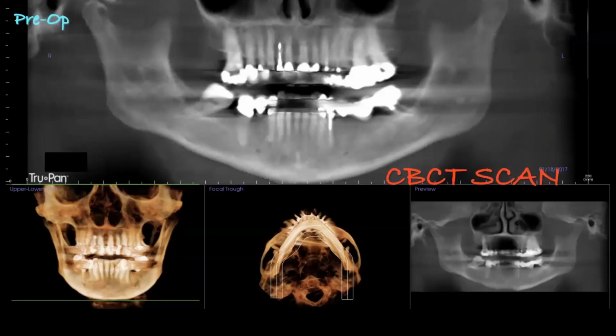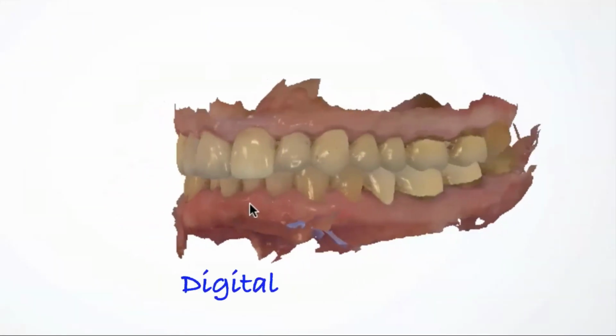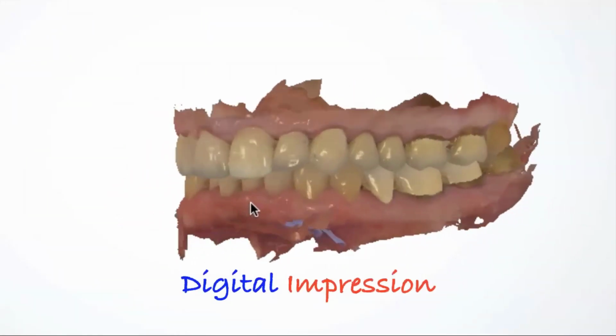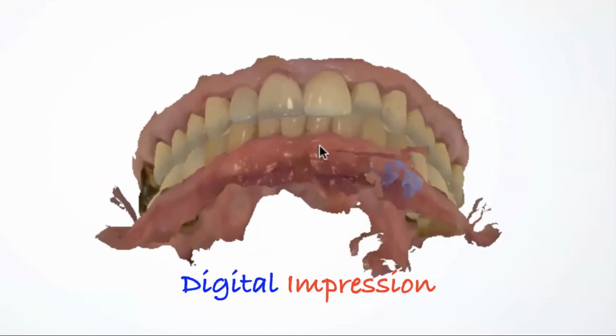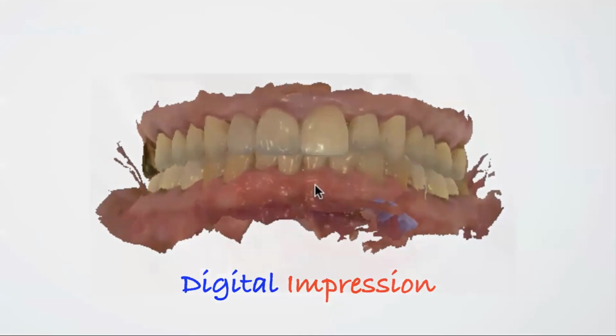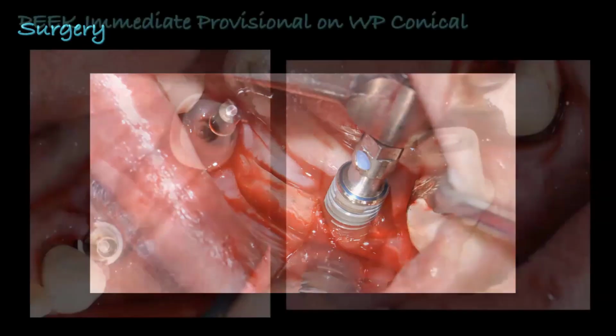So the scatter sometimes cannot be fun. That being said, there's settings to make this better as well. You can take an iOS scan in this particular case if you wanted to, and you could do it with a static guided surgery where you would actually have the ability to have a template and then do it. Or like I did in this case, I can go right into it and use real-time guided surgery and place these 2 implants using the XNAV system, and then drill my osteotomies, check them on the screen at all times, know where I am in 3 dimensions at all times. And then at that point, be able to place implants.